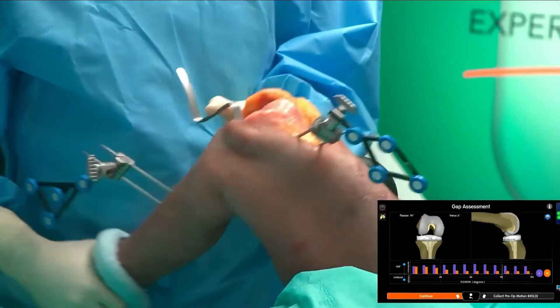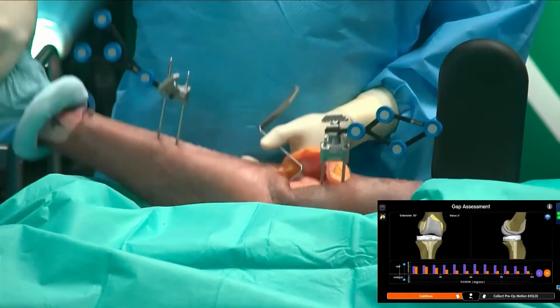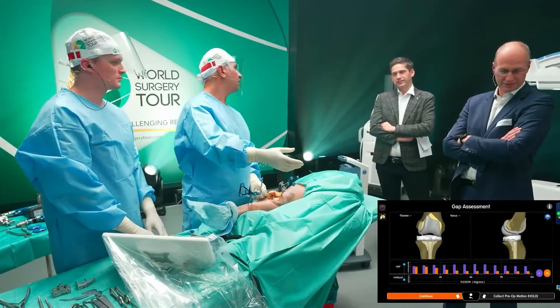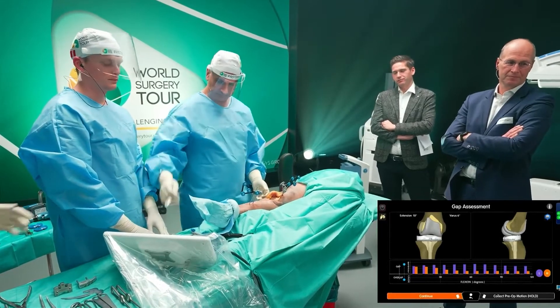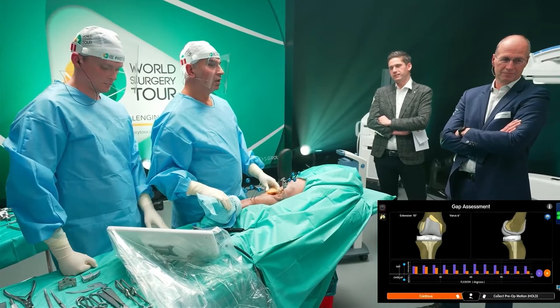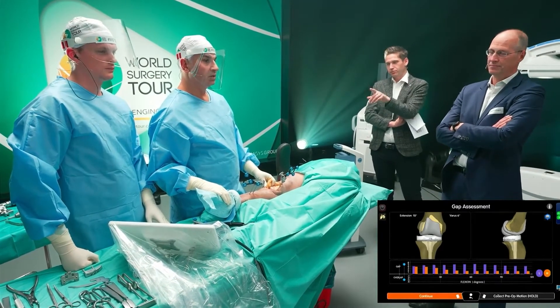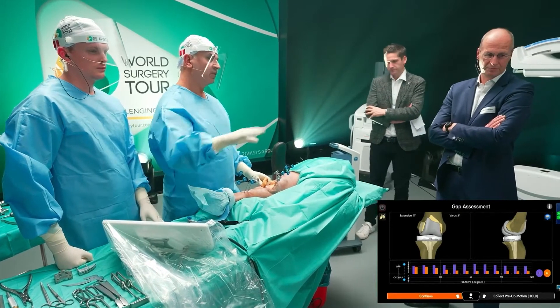Is this the real gap or is that a simulation of the postoperative situation? So this is the gap with this prosthesis in this position, collecting the ligaments. It is basically a virtual simulation of what the gap would be like if you put the prosthesis in the way you just planned it. Absolutely. So I'm pretty happy with that screen.